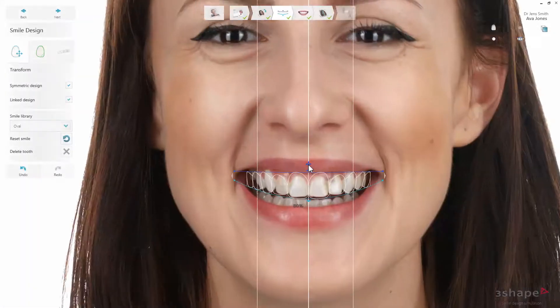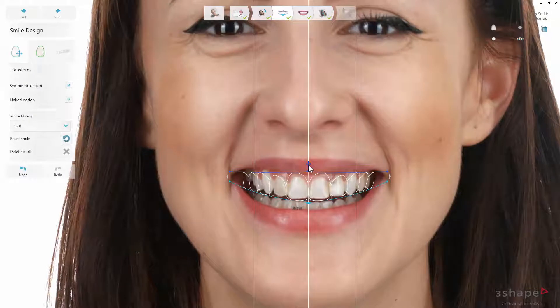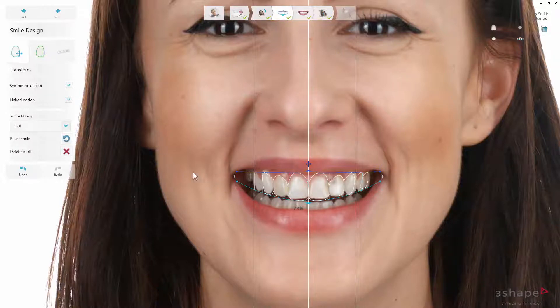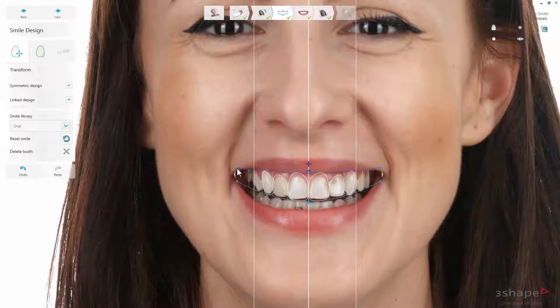The software will provide you with an initial design of the smile. You can remove the teeth that you don't wish to treat by marking them and pressing Delete. Use the available tools to create a smile design.